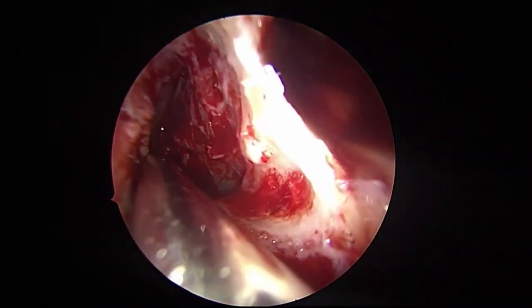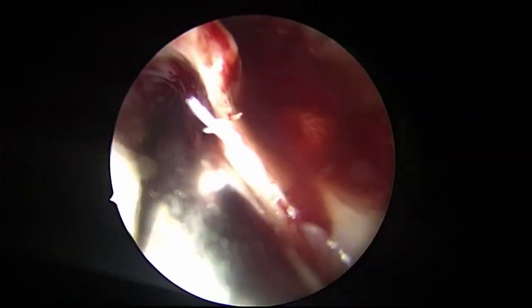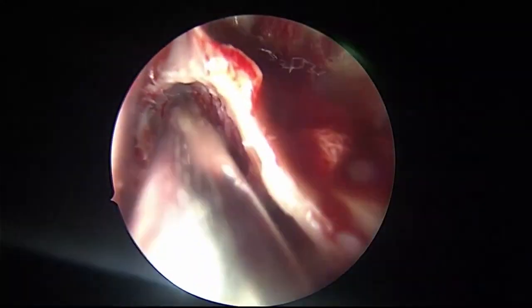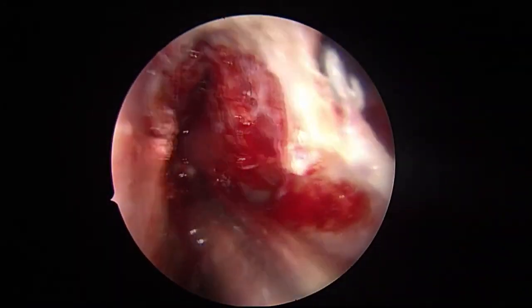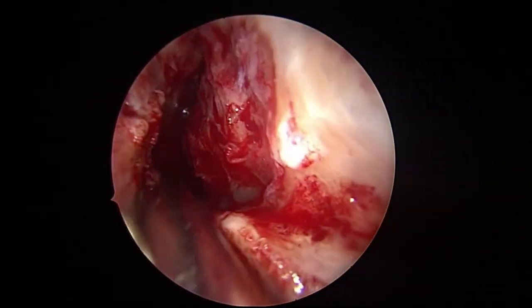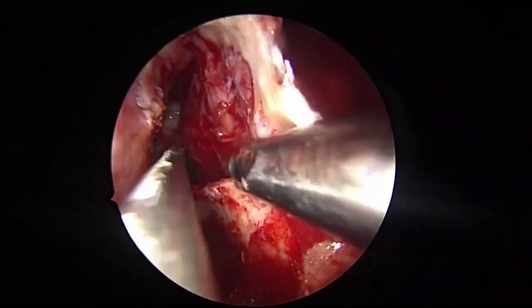Now see. See the level of the roof. That is most important. So one doubt here: do you have any problem with vestibular stenosis when you do this approach in extended endoscopic surgery? Not really. Why? We are not creating any raw area, circumferential raw area. There is no question of vestibular stenosis.